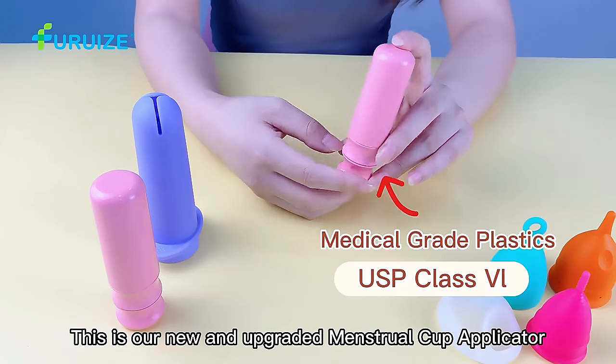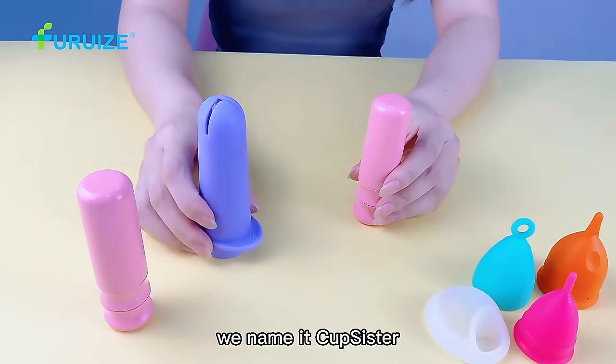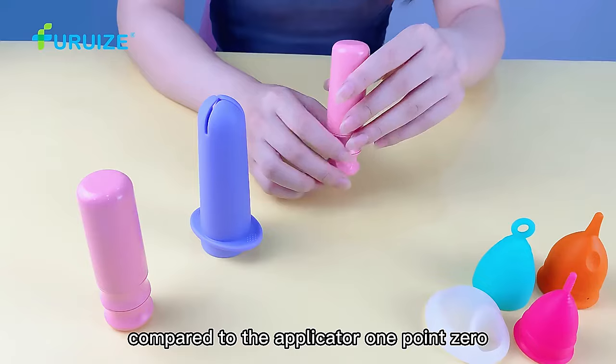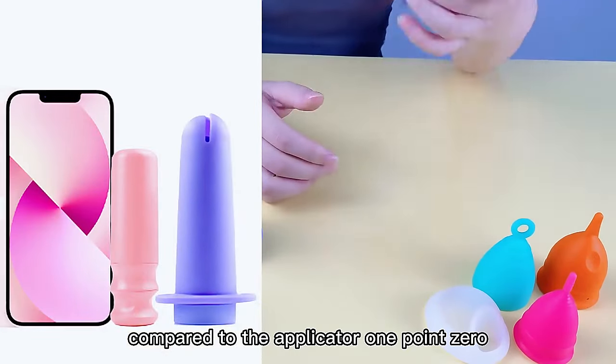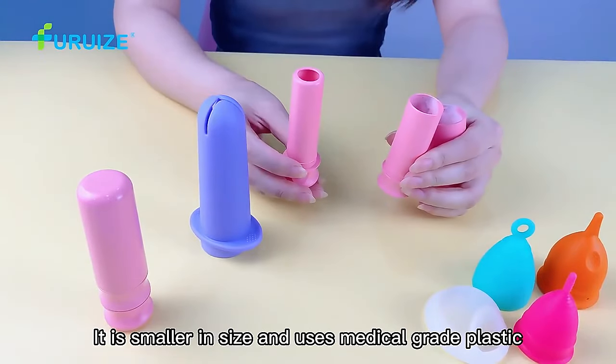This is our new and upgraded menstrual cup applicator, we name it Cup Sister. Compared to the applicator 1.0, it is smaller in size and uses medical grade plastic.